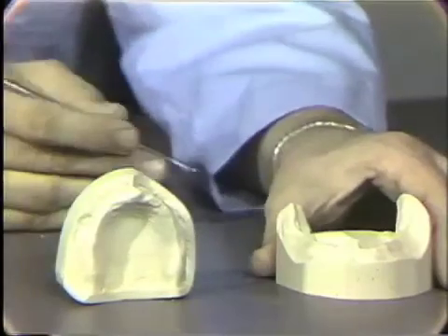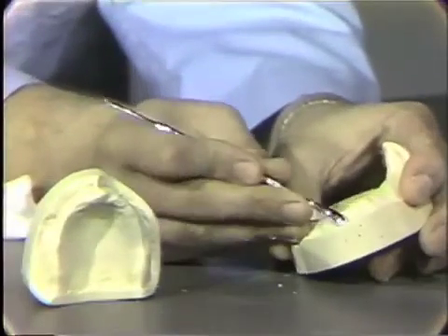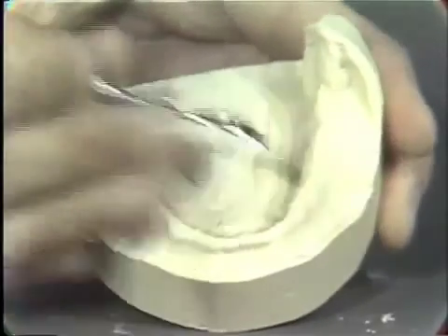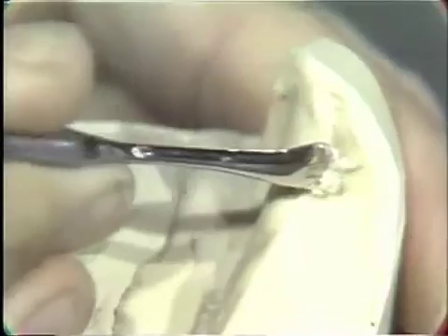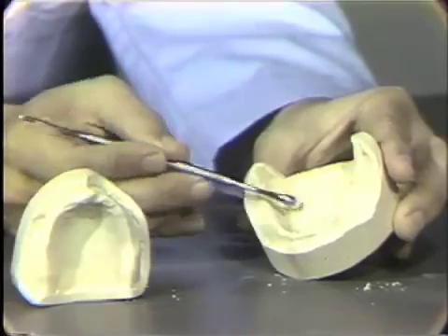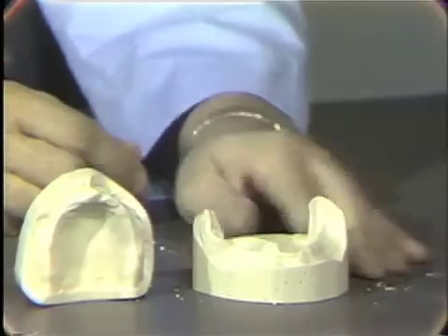Now on the mandibular model we had a few small imperfections. We have one located down here — we can pop that one off — and we have a few down in here, one in here, and as I turn this toward you, I think you can see we have one right here and one up in this vicinity. Remove all of these. The tongue space is now wide open, giving us access for our wax up and things of that nature, in preparation for the construction of our trays.